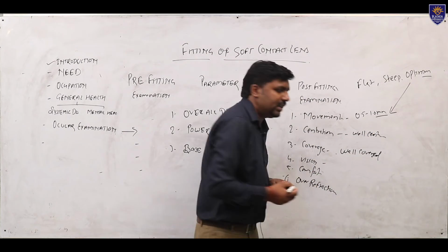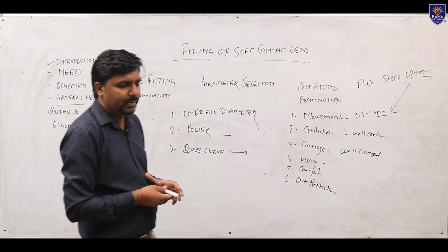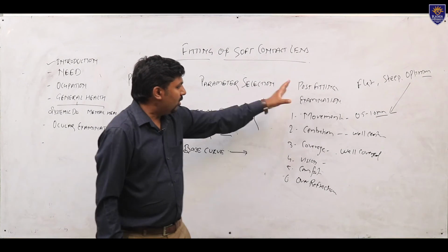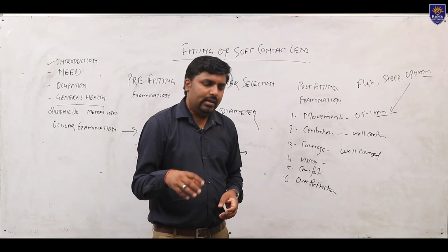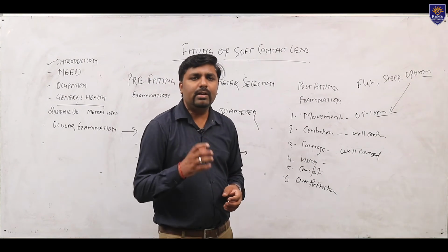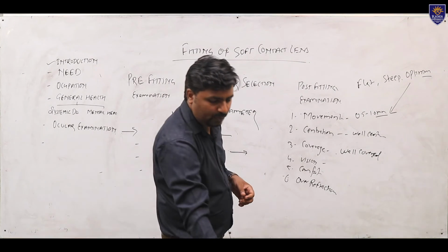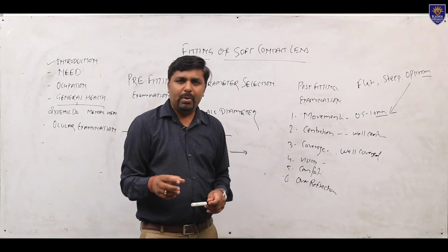Then is vision. After using the contact lenses, after stability, after 10 to 20 minutes, we will do all this post fitting examination. On that we will do the vision. We have to achieve the maximum vision the patient's eye has. So, after using the contact lenses, is the patient getting proper vision or not?